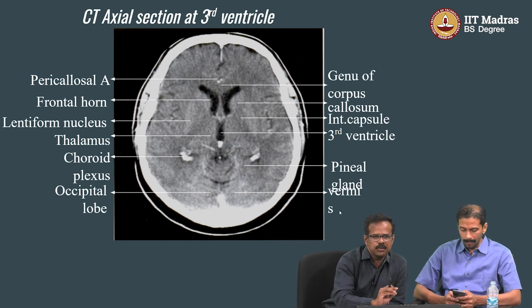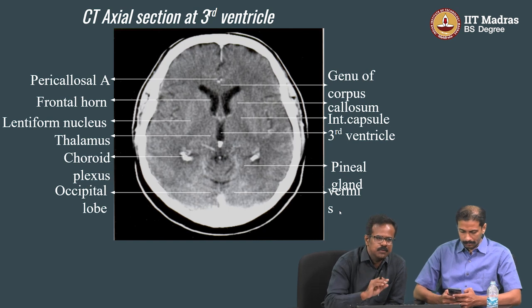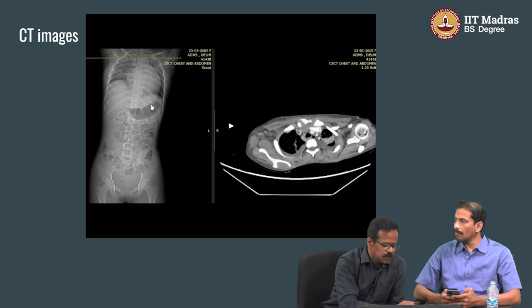As a domain expert, as you asked, we will annotate the data or these images in a particular way which will be understandable to the computer machine as well as the data scientist. So in that way we learn these images.